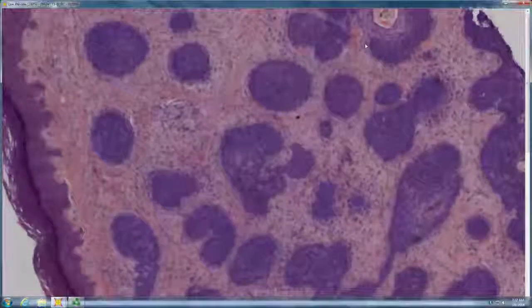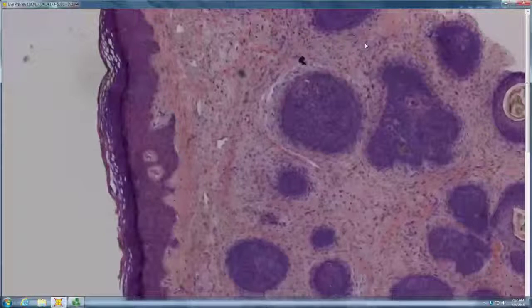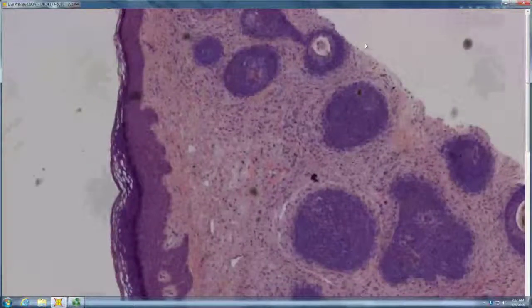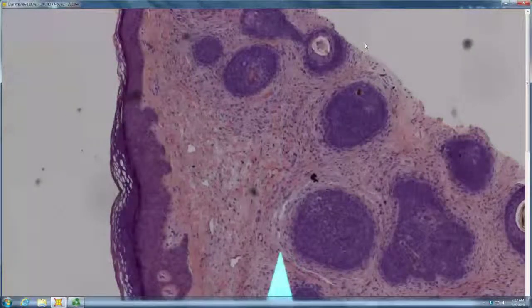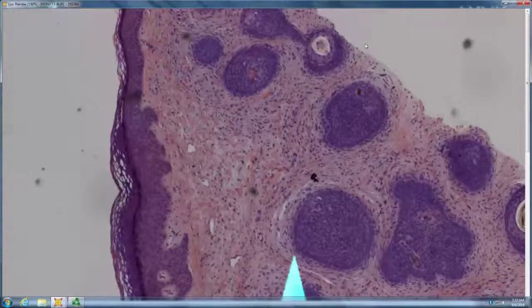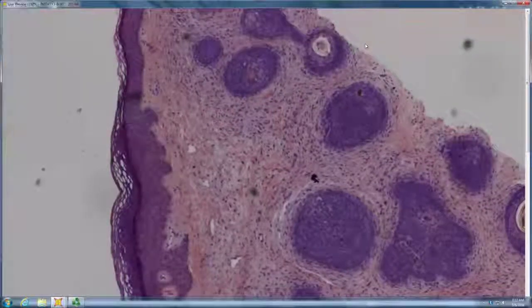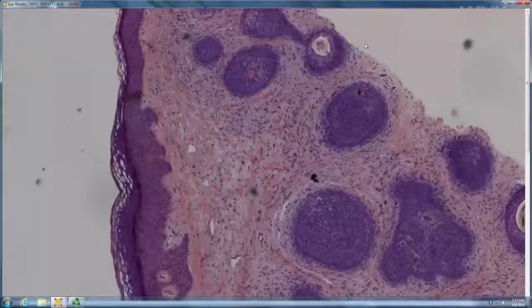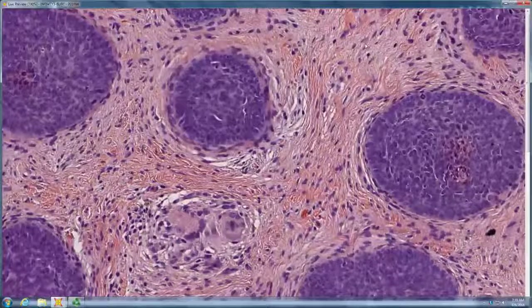Okay, so lots of basaloid cells, clefts within the stroma. So there's no retraction space between the tumor and stroma as there would be in a basal cell. Instead, there's clefting within the stroma. There's a fibroblast-rich, concentric stroma similar to what one would see around a hair follicle. Right? And there are these collections of plump fibroblasts over here.